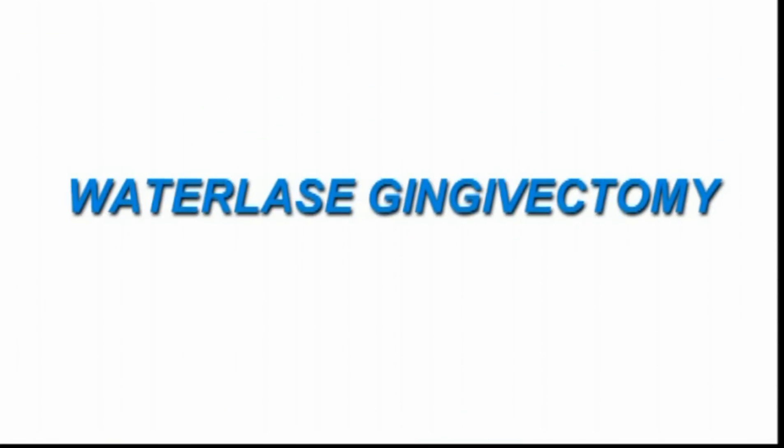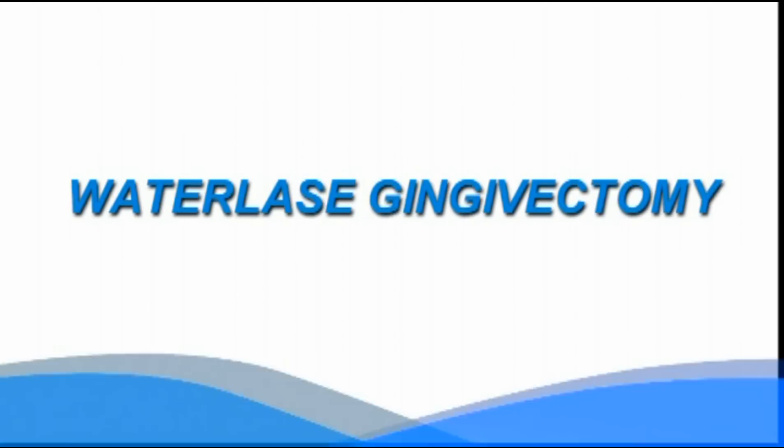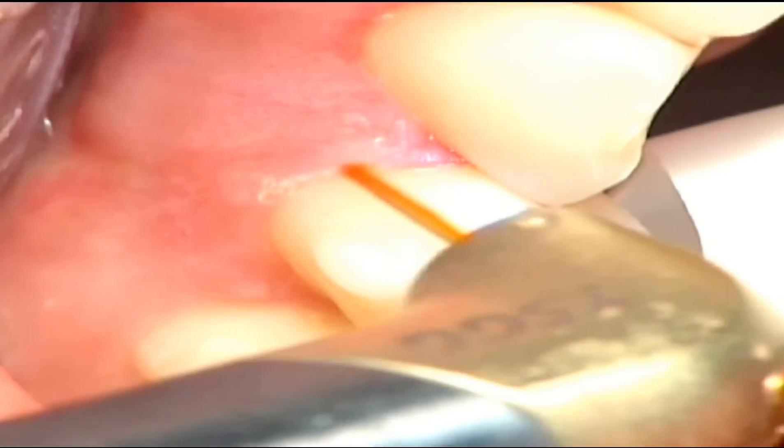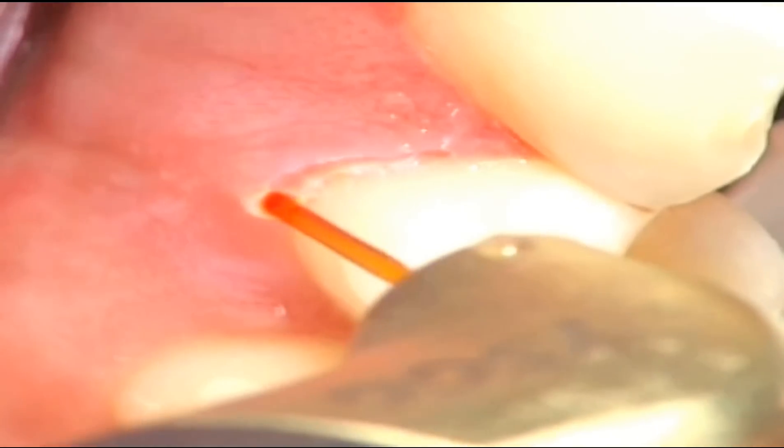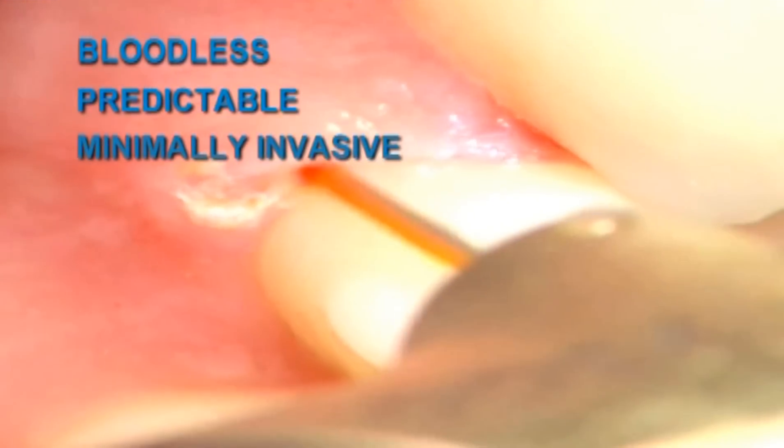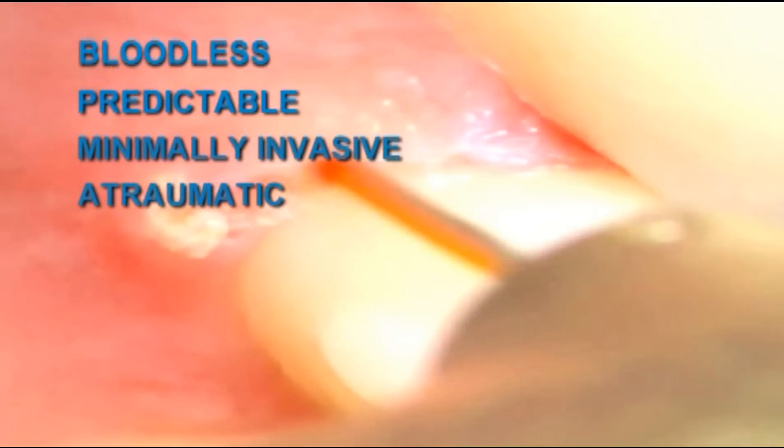Let's go through a common procedure, a Waterlase gingivectomy, to see how all of these settings work together to make soft tissue procedures easier for you. A Waterlase gingivectomy is a simple procedure with great clinical outcomes and patient benefits. The procedure is bloodless, predictable, minimally invasive, and atraumatic for the patient.